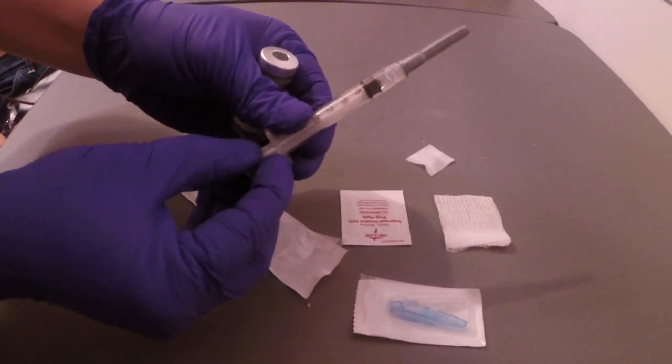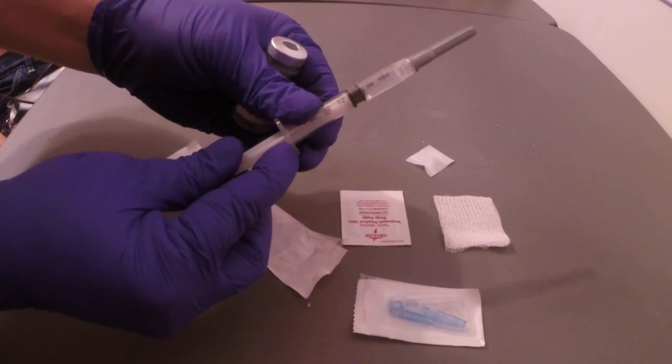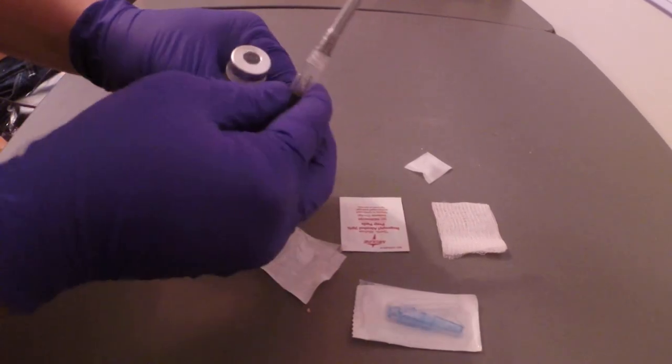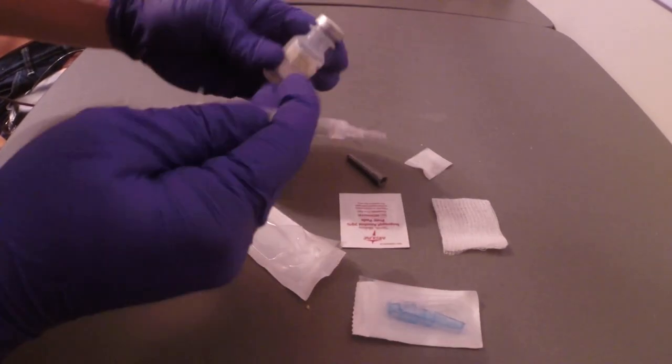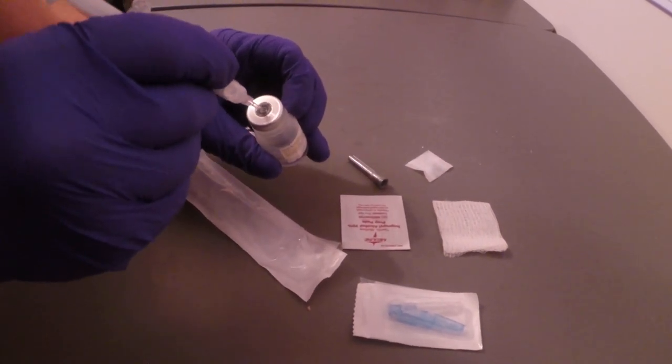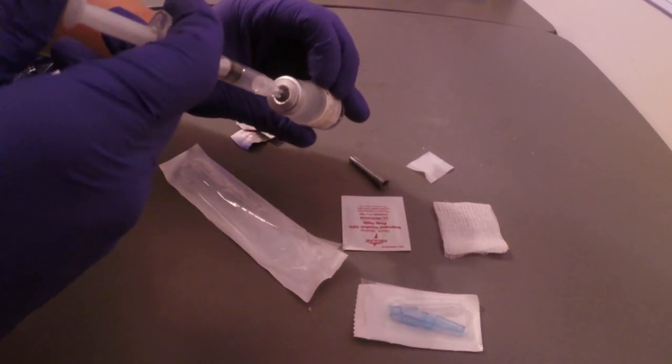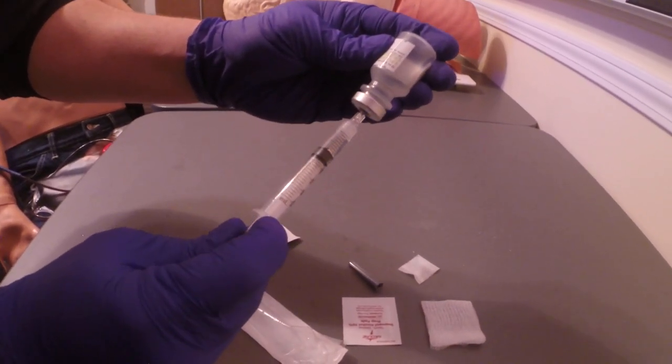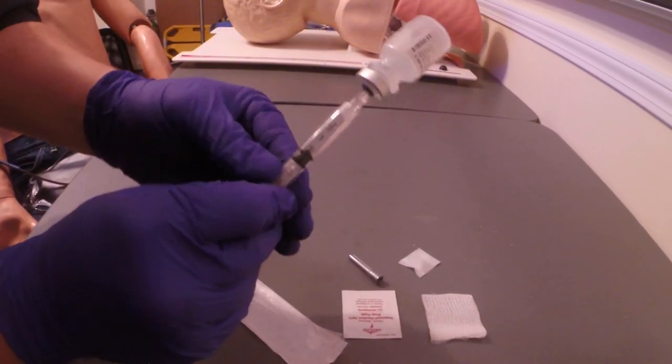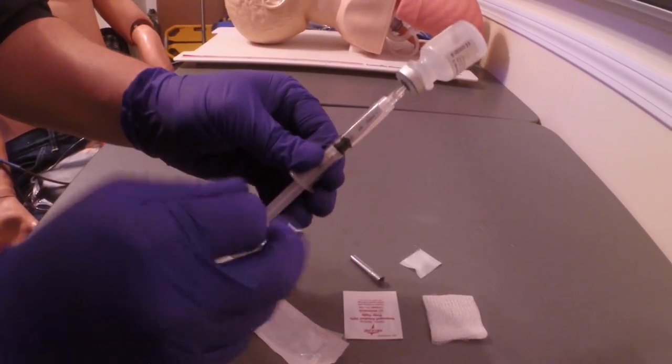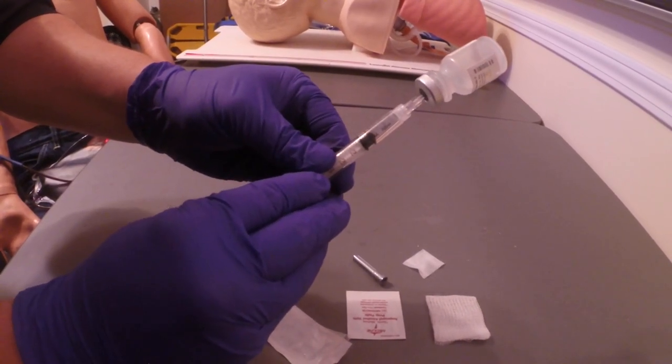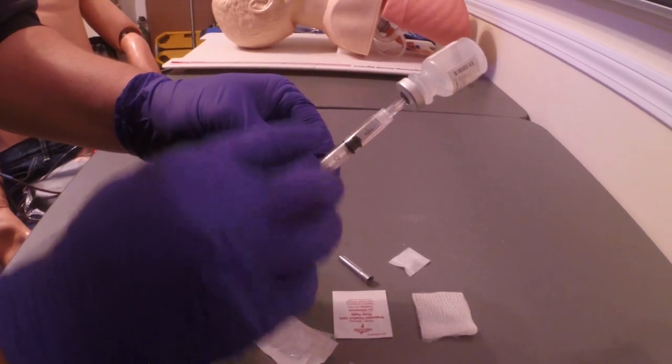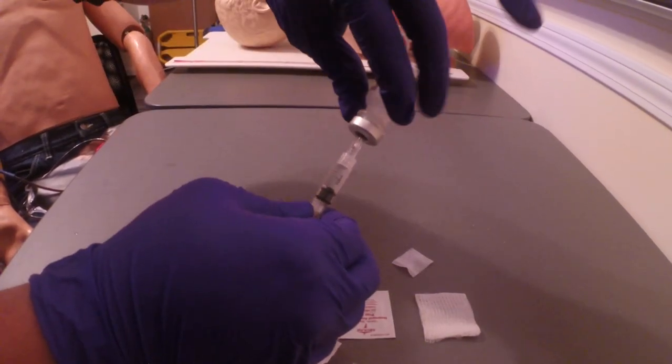Withdraw the amount of air into the syringe that we need for medication, which is 1 ml. So we'll push through the rubber, inject the 1 ml of air, and then withdraw 1 ml or 1 cc of fluid, tap out bubbles, push back up till you're level with the 1 cc.